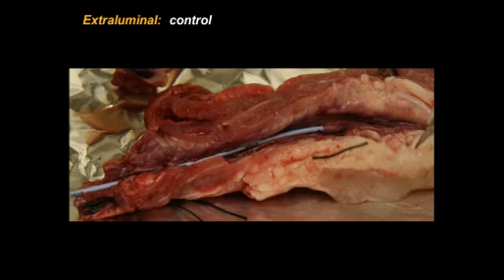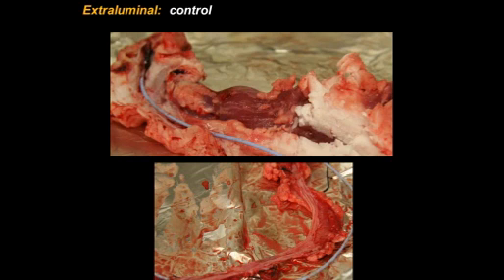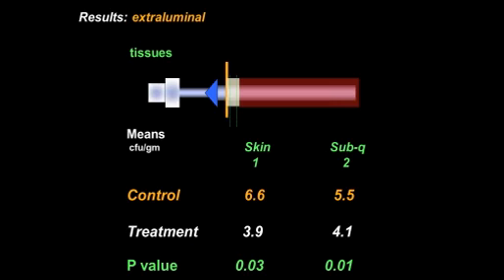And in incising the vein open, now we see both a lot of fibrin sheath formation as well as thrombus formation in the vein itself, and very extensive necrotic tissue and cellulitis. So compare then the control catheter with a high level of infection to the treatment catheter.